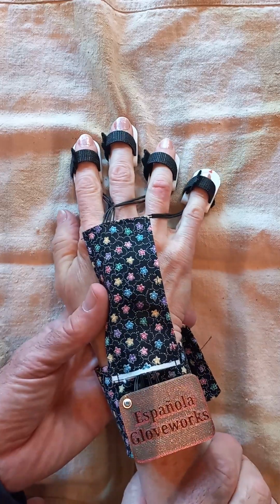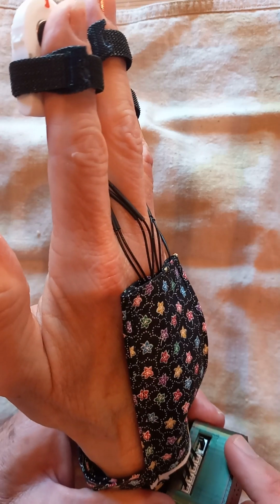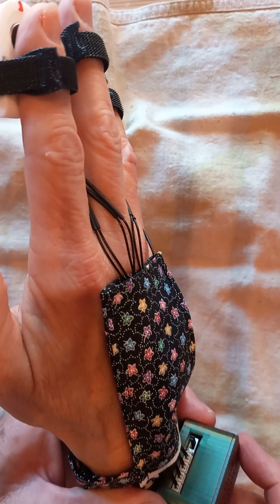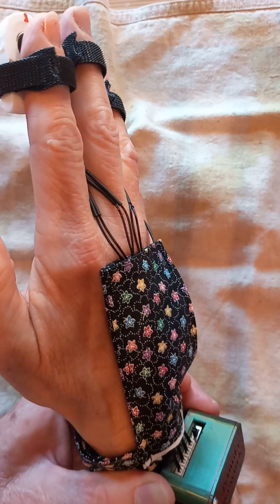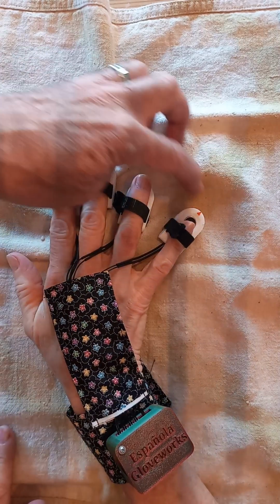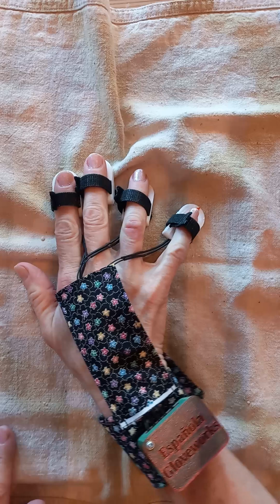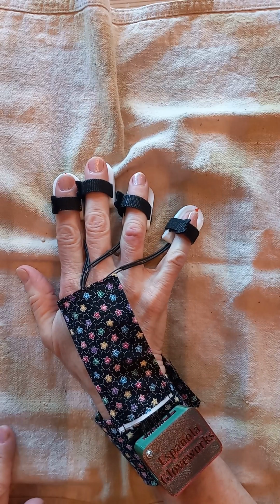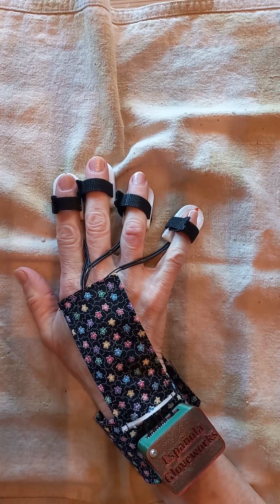So I'm going to lift your hand up this way, okay, so that we can see the switch, right? And so when the switch is away from the wires, the glove is off, and when the switch is towards the wires, the glove is on, right? And we should now be feeling very brief vibrations, about 1/10 of a second into each of the fingers, and that happens all 4 fingers at once, and then all 4 fingers again, one at a time, and then 2 large pauses, and then a repetition, but not an exact repetition.